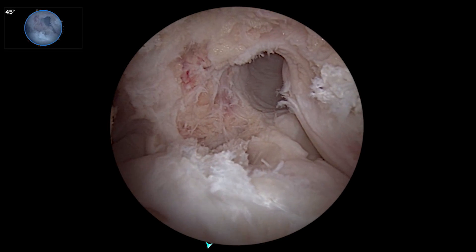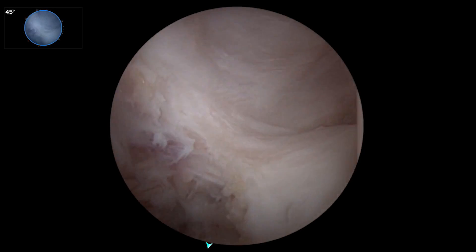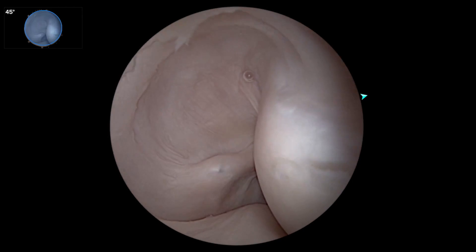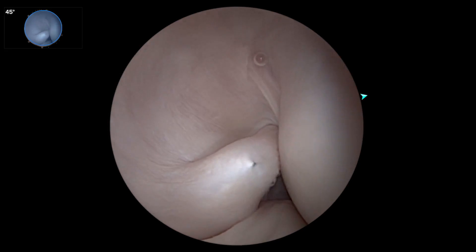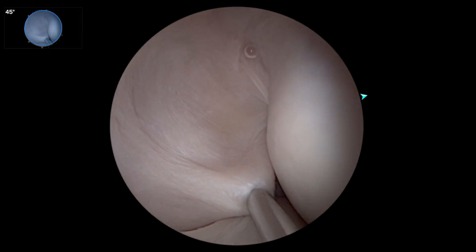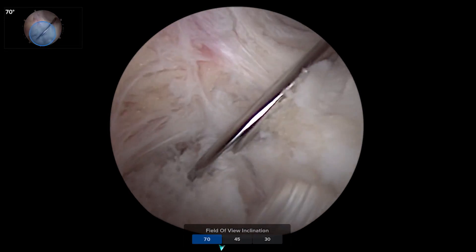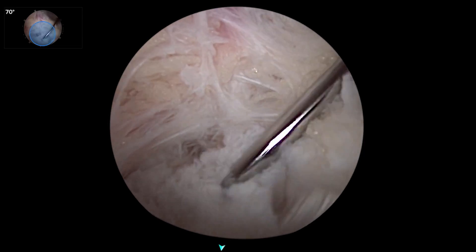I'm already looking in this posterolateral ramp area where I'll be putting a cannula to work back here — putting in the posteromedial portal with this panoramic or wide-angle view. You're just seeing this posterior pouch and posterolateral corner with a much bigger view than you'd normally get. Then I can immediately switch back to my 70-degree view that takes me right down into the PCL footprint.